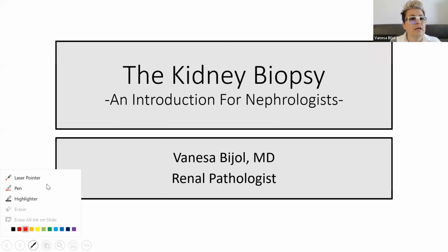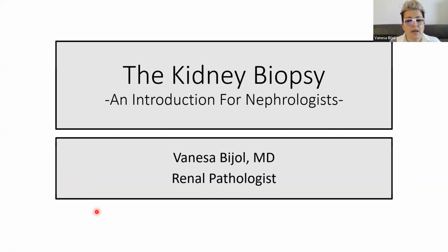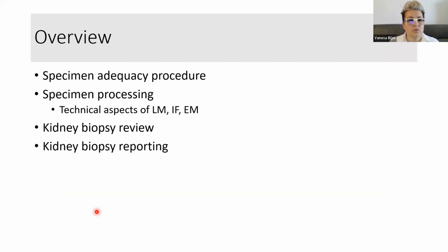So let me get my pointer. And this is what we will be covering today. I really wanted to talk about the kidney biopsy from the moment we get it, to how we process it, and how we actually review it. And at the end, I will talk a little bit about the kidney biopsy reporting, at least the way I do it. And please take that as just my personal way of handling it.